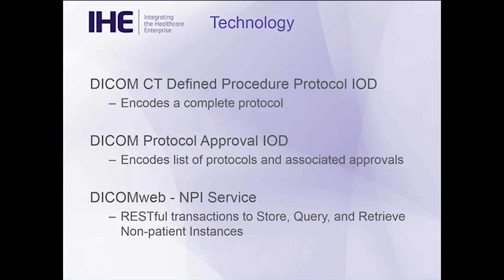And then finally, to move the objects around, this is a little bit cutting edge, I guess. We've adopted the DICOMweb specification. People are probably familiar with the conventional DIMSE DICOM services, the C-Store, the C-Find.